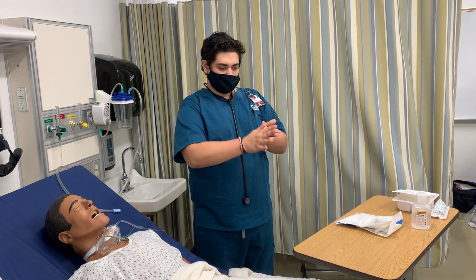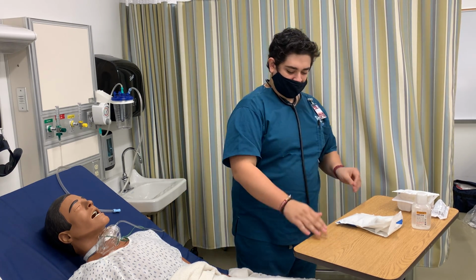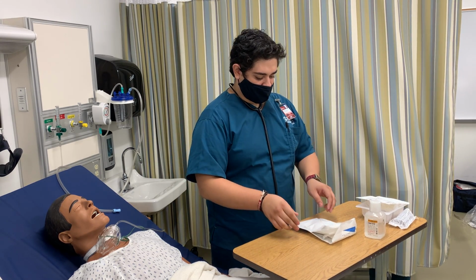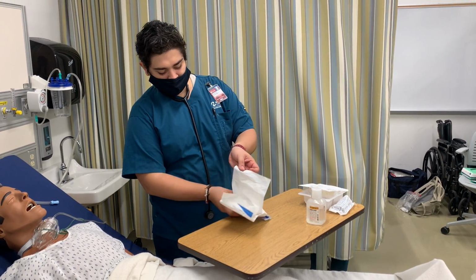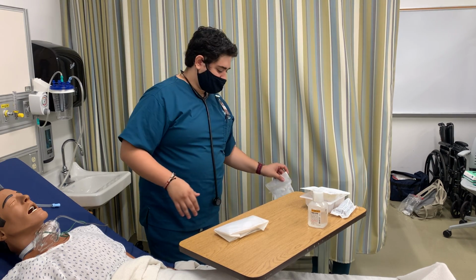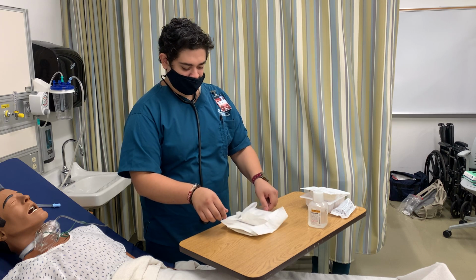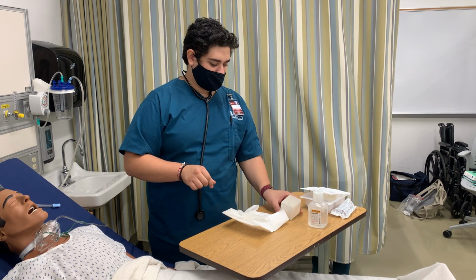Okay, so as determined, there will be a need for suctioning, so I will be readying my sterile field. I have my trash can right here. I have my little bowl here.